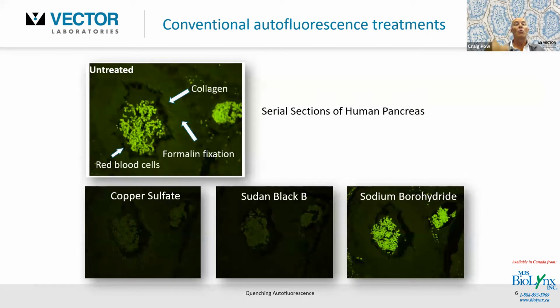So going back to my original image there, showing you the problems with the inherent autofluorescence due to, say, red blood cells, collagens, elastins, or indeed induced through the use of an aldehyde-based fixative. Copper sulfate, you can still see some of the collagen in there, the aldehyde-fixed residual fluorescence, and the red blood cells. This is an ink-based reagent, Sudan black. Again, not particularly effective against some of these compounds or cellular components.